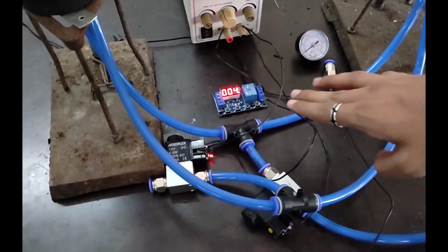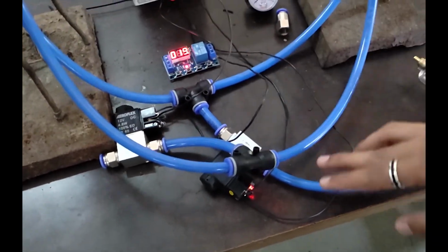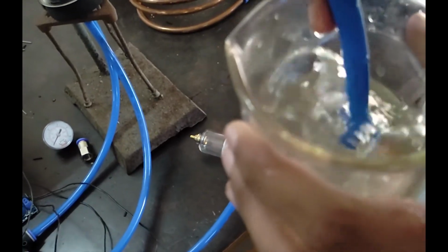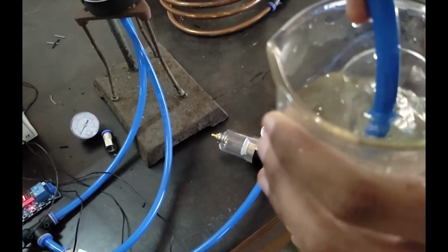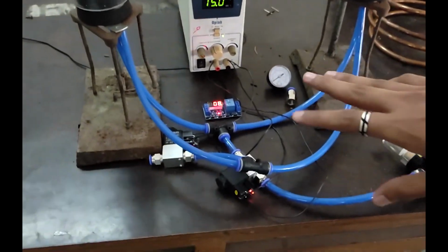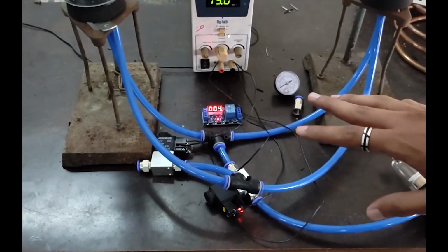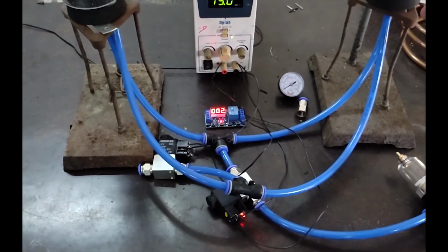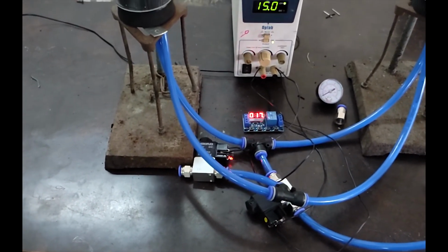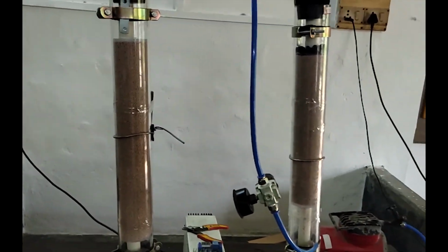And here you can see that the switching will happen after 1 second. Here you can see that again the air is getting supplied at the output. So there is synchronization between both of the solenoid valves, and we have kept the cycle of 20 seconds. The air is getting vented for 20 seconds, and again the air is getting filled in the columns for 20 seconds. So this is the actual demonstration or working of our project.